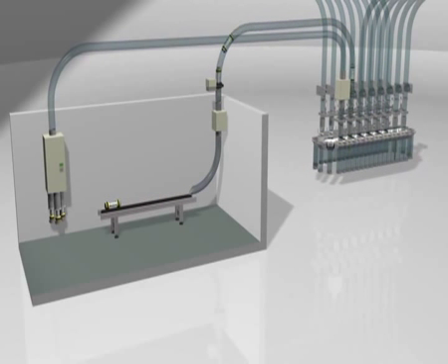The carriers can be sent consecutively to a multi-receiving station via a line distribution unit or a power transfer. Upon arrival, the carriers are gently ejected one by one. Up to 8 carriers can be transported through one line. The same principle applies when empty carriers are returned. They are placed into the station's dispatch magazine and subsequently sent back to their station of origin completely automatically.